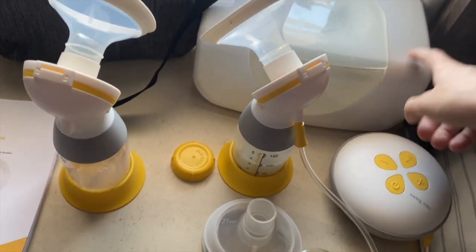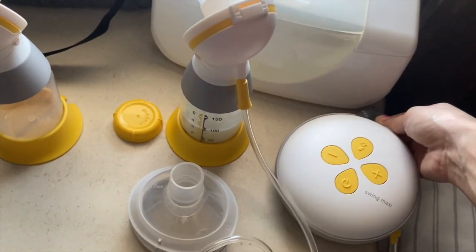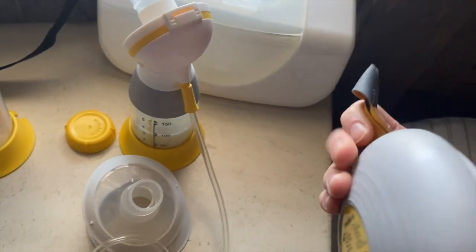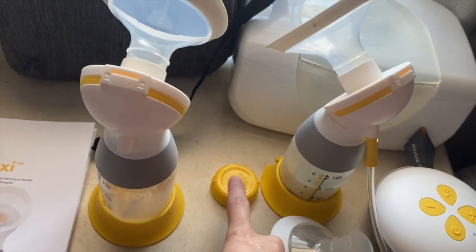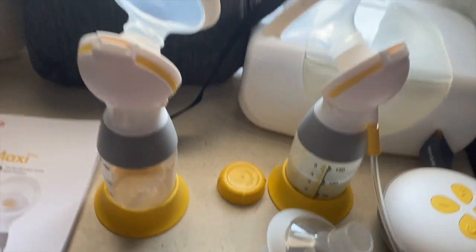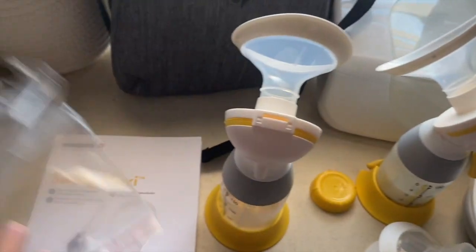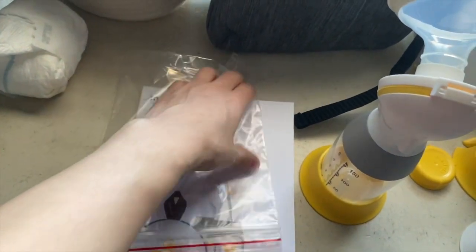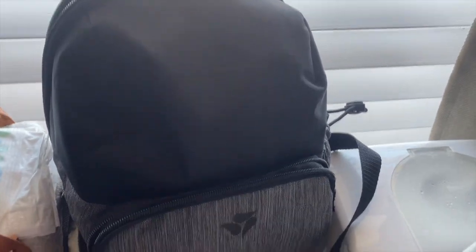This is the pump itself — it's portable, and the charging port is right here. It comes with two extra shields, another lid, two of the main pieces — one for each side — the backpack, a booklet, and extra bags. I'm not entirely sure what the bags are for, but maybe they're for disposing of supplies after use.